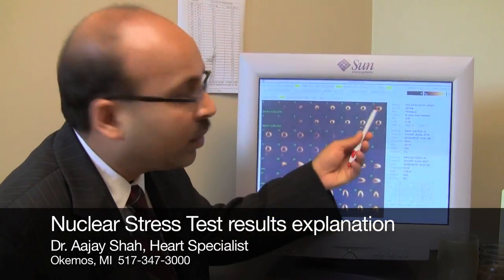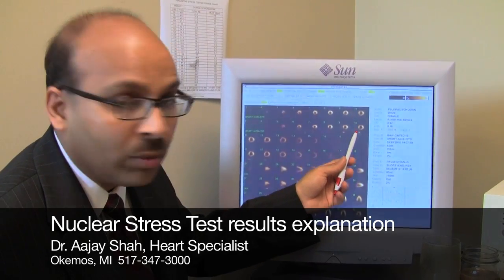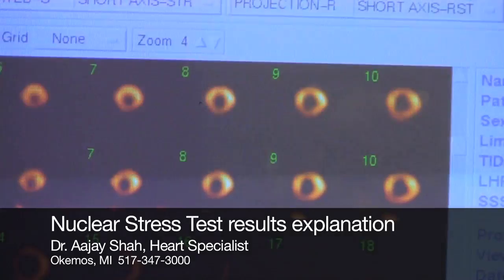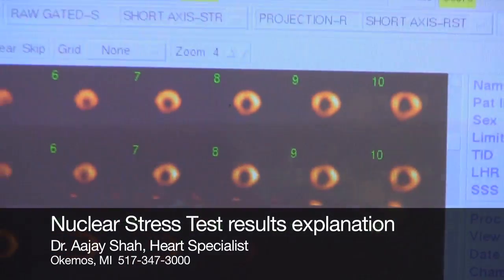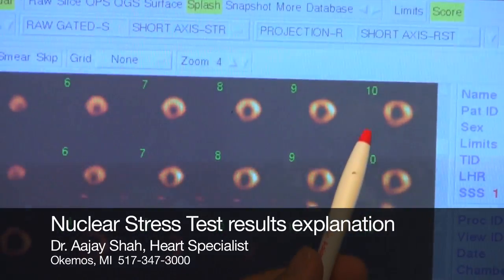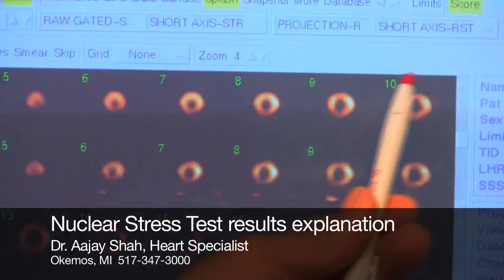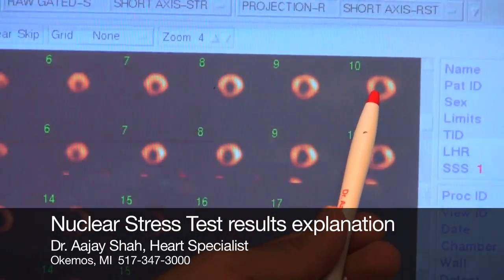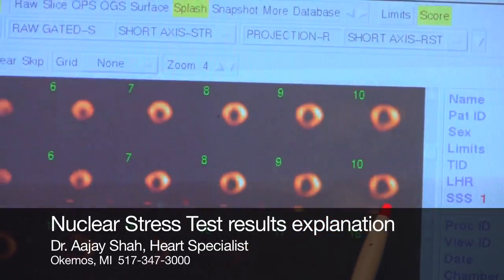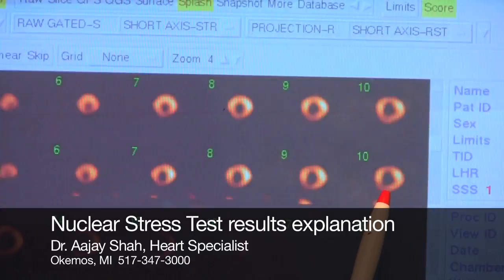So we took two sets of pictures when you came. First we took the pictures at rest, and then we took pictures under stress. As you can see, the heart muscle is cut in a bread loaf way — or like cutting a doughnut. So here is what I call a doughnut hole for the heart muscle. You can see the color in this particular person is very uniformly distributed. This is when the person was having stress on the heart, and the second set of pictures right below it is when we took pictures while the person was resting.